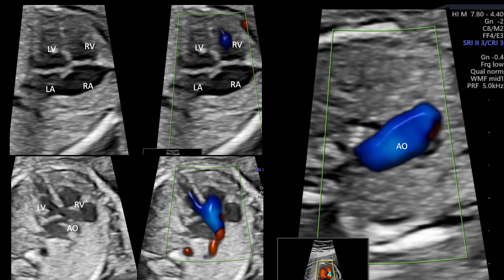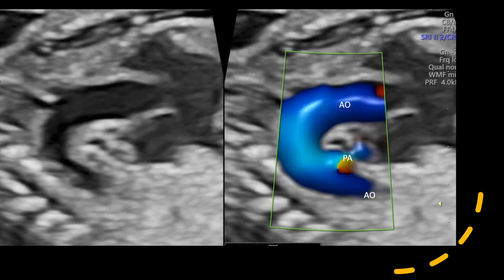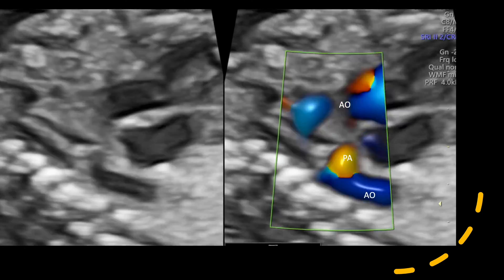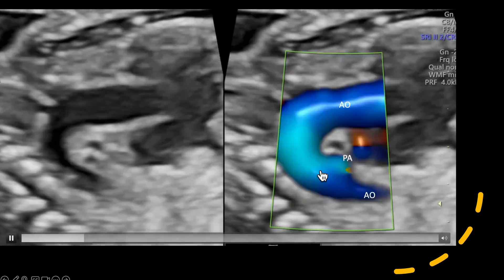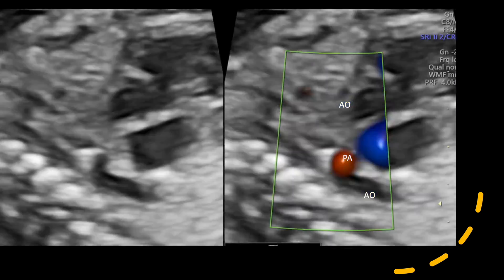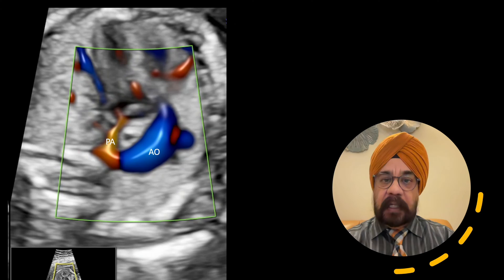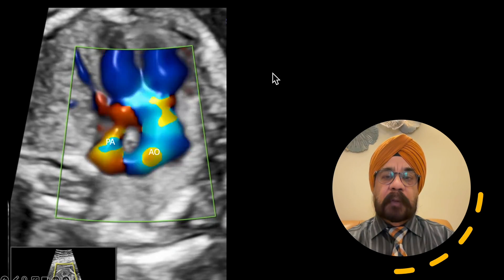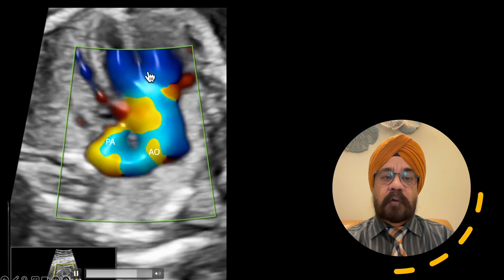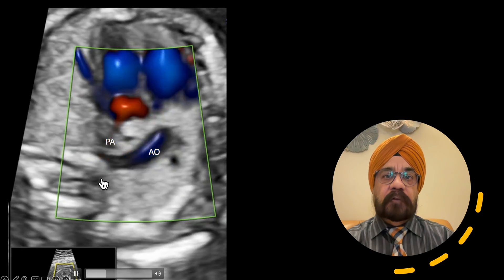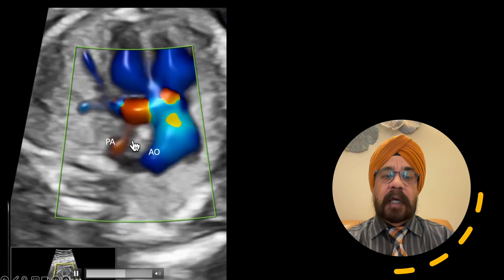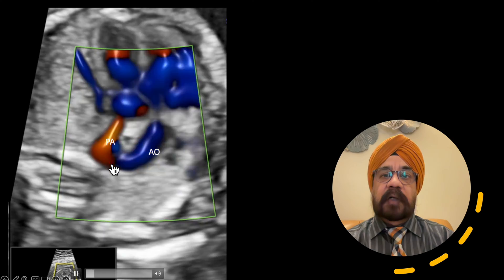We go to a sagittal view and here you do not see the pulmonary artery coming out of the right ventricle, but you see a pulmonary artery which is filling retrogradely from the aorta — this is the PA filling from the ductus arteriosus. The pulmonary artery is showing retrograde flow and the trachea is sitting in the center, meaning this is a right-sided aortic arch with a left-sided ductus.